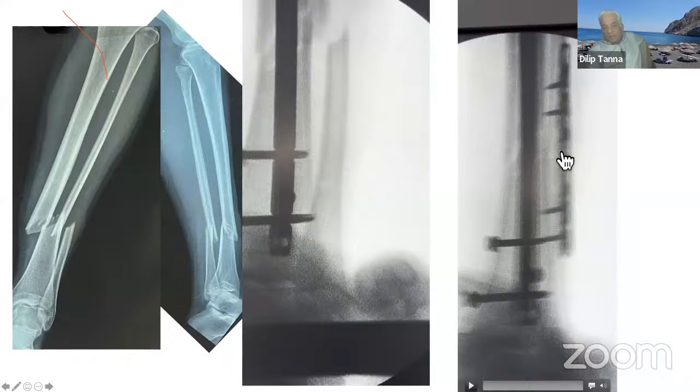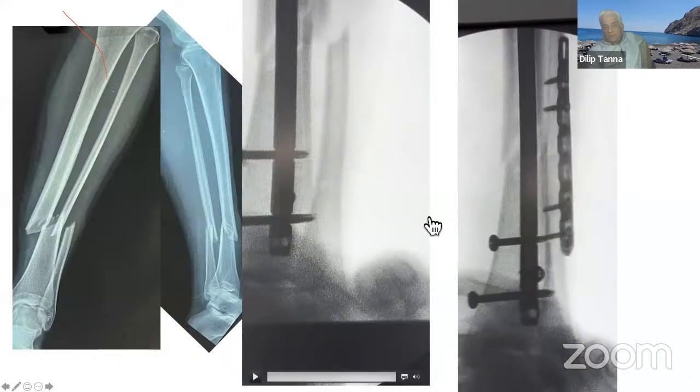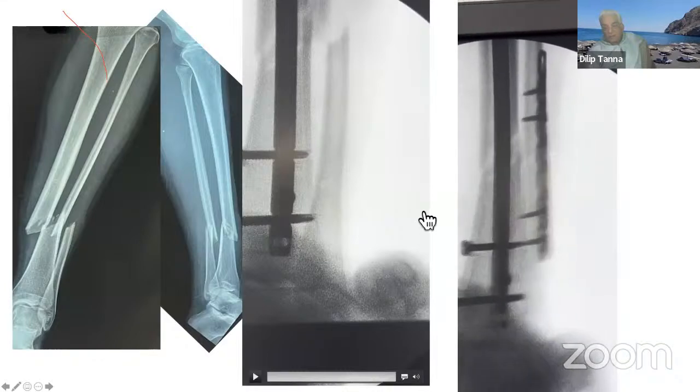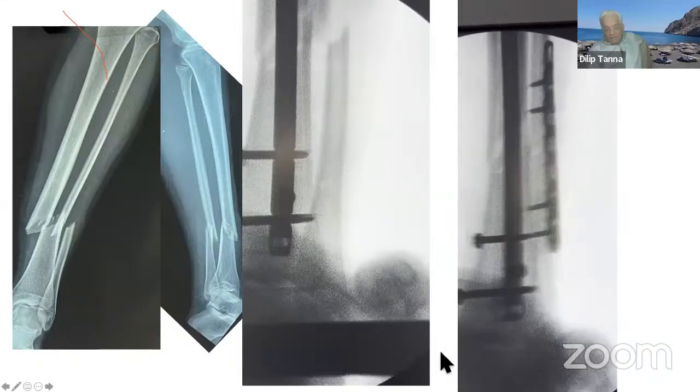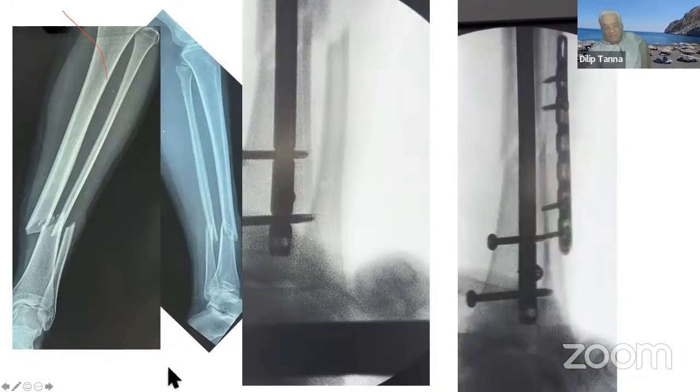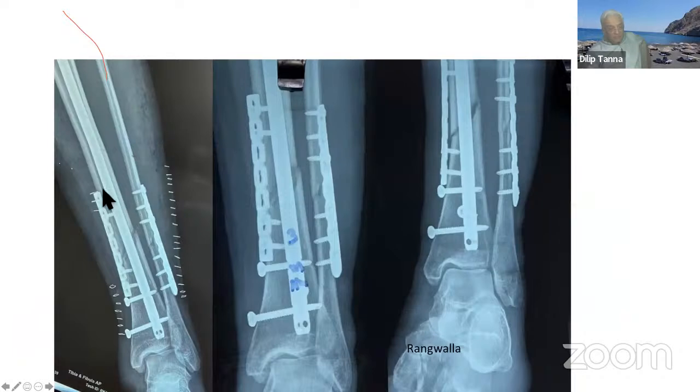Now I did the plating of the fibula. And you can see the movement. So I said that there is no point in hesitating. It could have healed up, it may not have healed up, I'm not sure. So I added up another plate, long plate, 3 months.